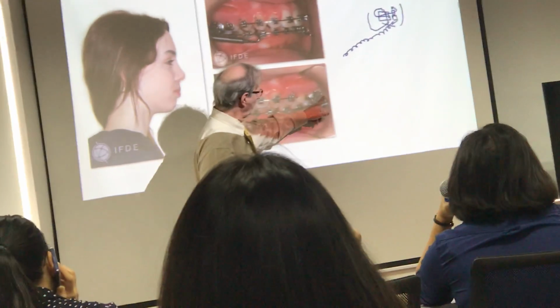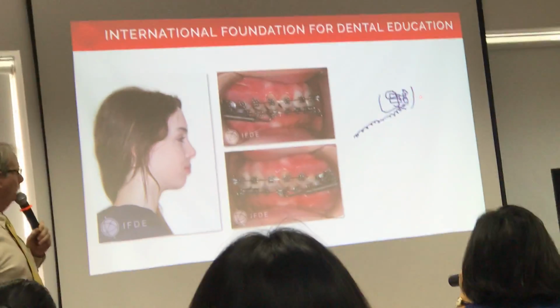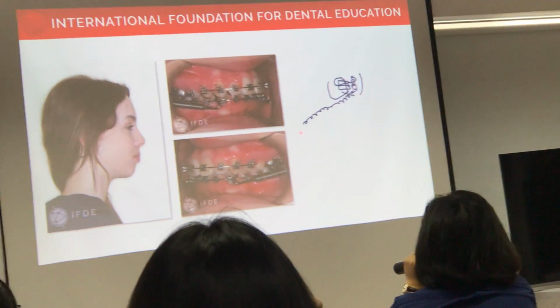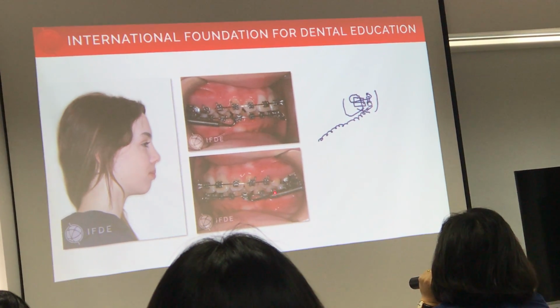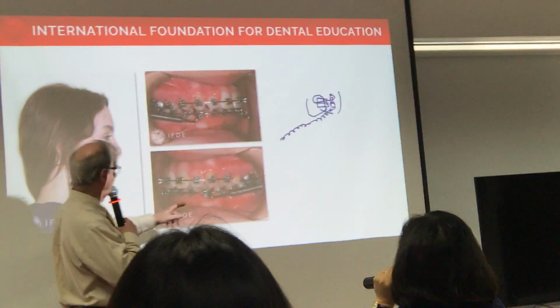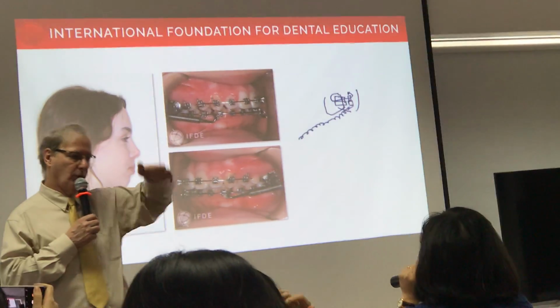You can even put some form of a stop, push it even more. Normally in clinic, at the back I often put it here. But in front, it depends. If I want more vertical, I will do the premolar. Or I will put a hook here, or on the canine. Some people even go remote. You can do it the way you want. It's all about figuring out the force.